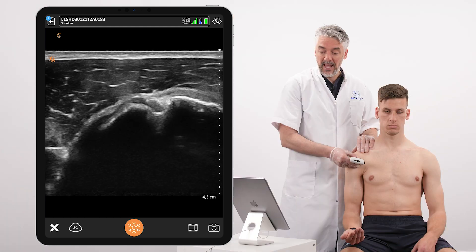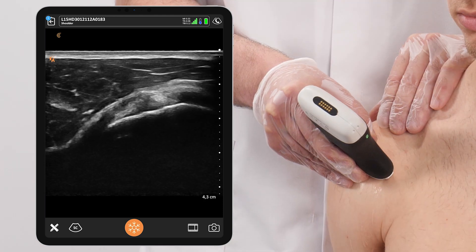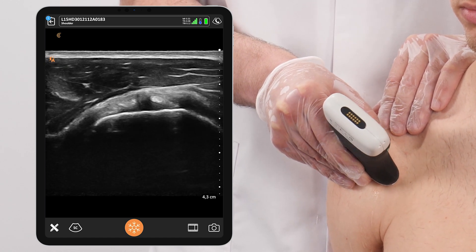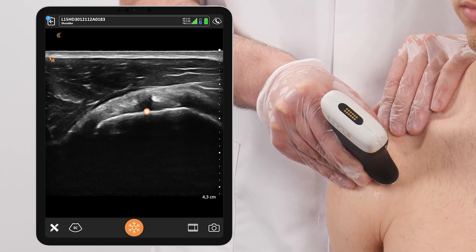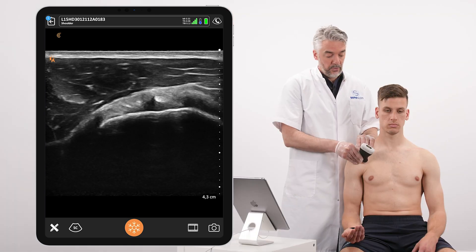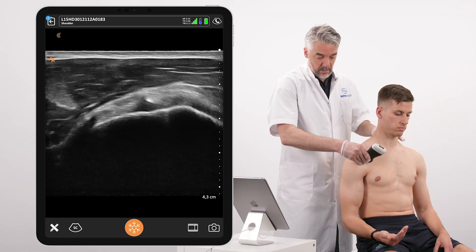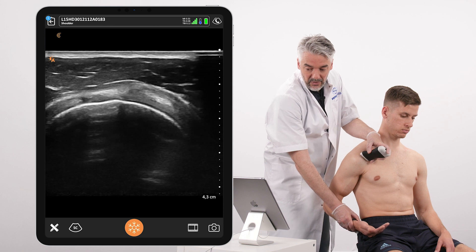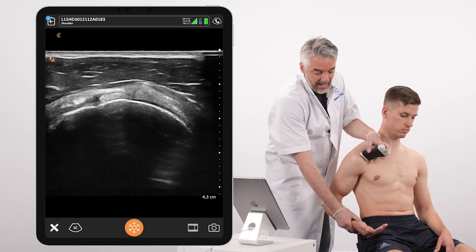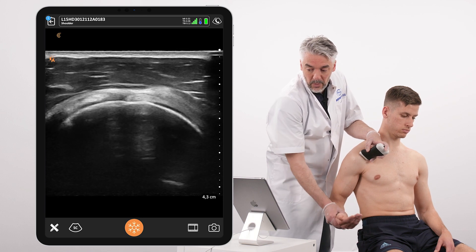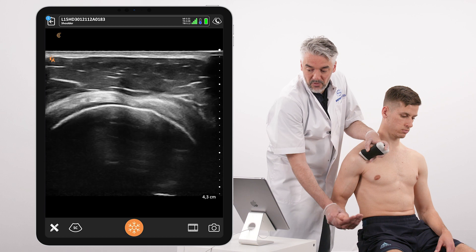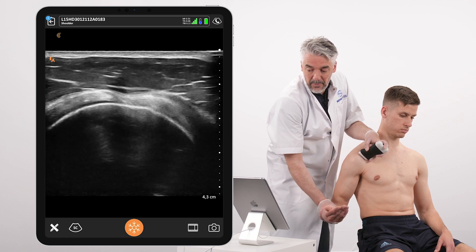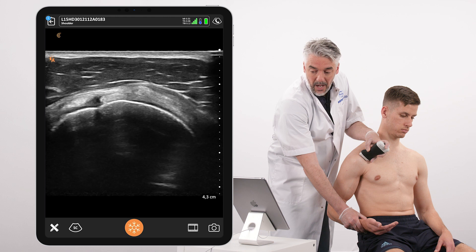Following the biceps back towards proximal, at this level we're going to look at the rotator interval and follow the biceps to assess the relationship with the coracohumeral ligament and also the superior glenohumeral ligament, both stabilizing the biceps tendon in the rotator interval. With the arm extended and internally and externally rotated, we want to see that the biceps follows the movement of the humeral head — this is what's happening here, which is healthy. In an unstable situation, you will see that the biceps will move in the opposite direction.